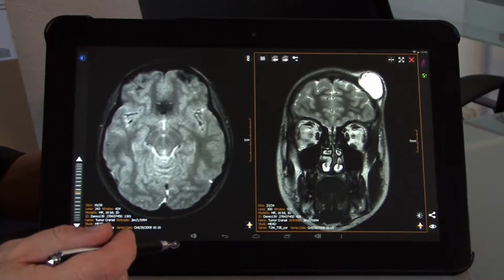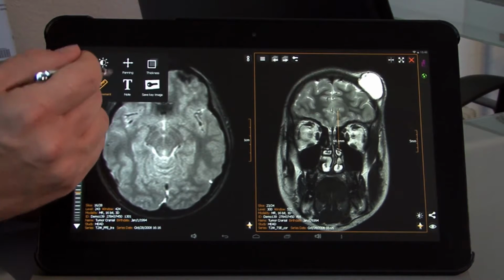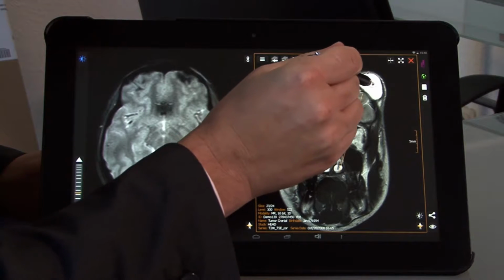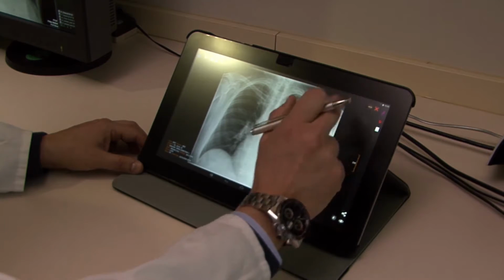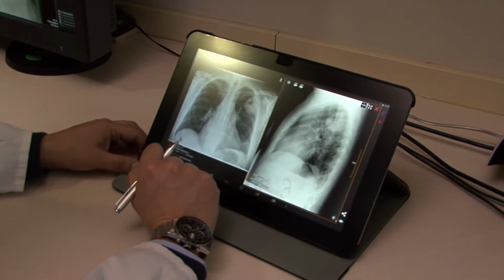MedTab can be operated in two different modes. In a color mode, which is optimized for color visualization, and a DICOM mode, which is optimized for grayscale images. The MedTab can always be used anywhere where you have sufficient ambient light conditions. But it's really challenging for the human eye to determine whether the ambient light is okay or too bright.